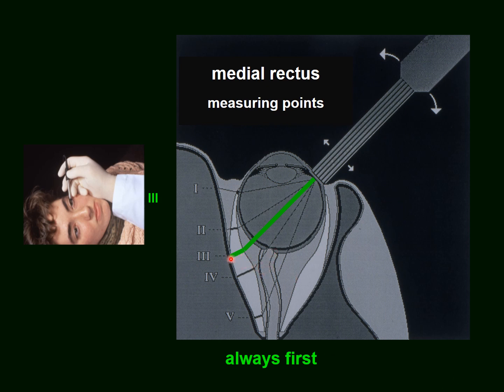The muscle lies right next to the bone, and as we angle the beam a little bit more posteriorly, anteriorly that is, the muscle goes away from the bony surface. So we aim as far posteriorly as we can to get a maximum signal of this muscle surface next to the bone surface that is still close to 100% display height. That's the way.